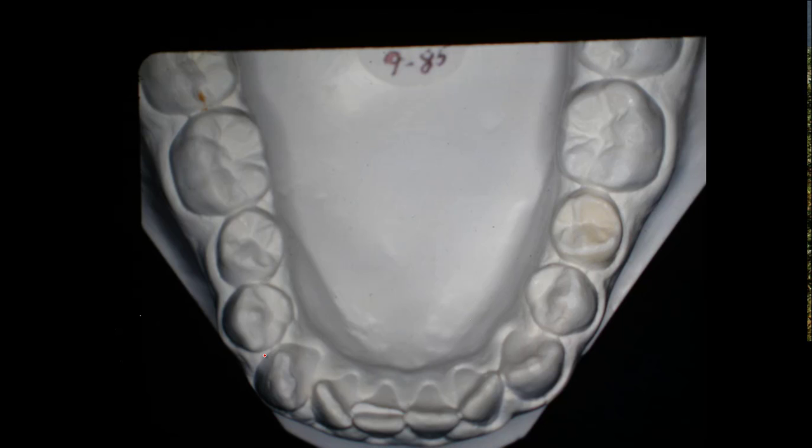There's what the lower jaw was to start with. See, this part right here was on the outside, and the upper teeth were back in here somewhere.